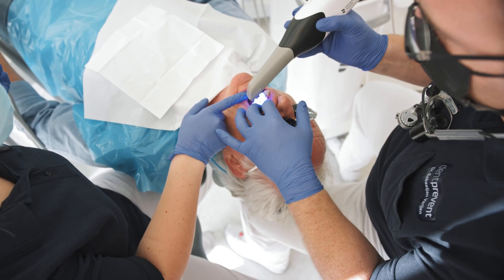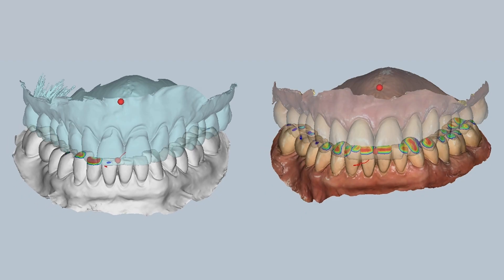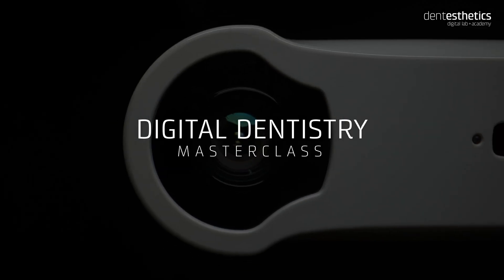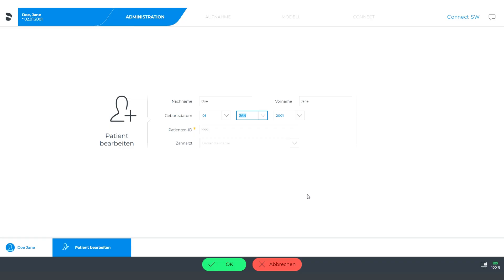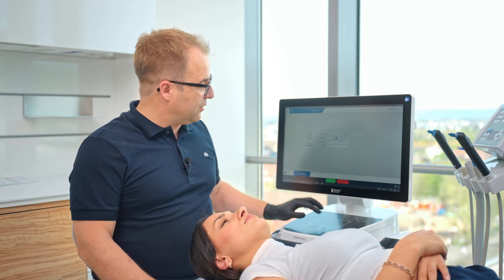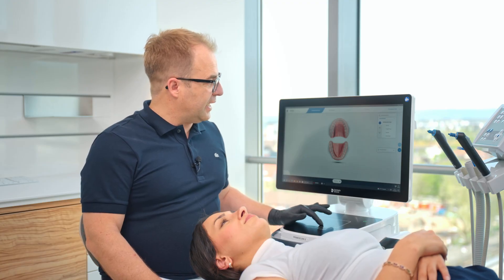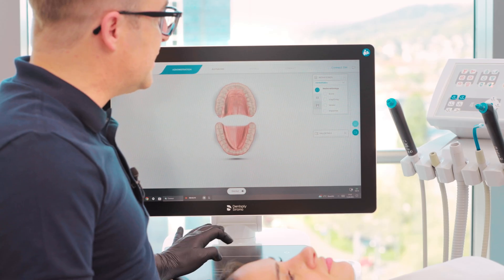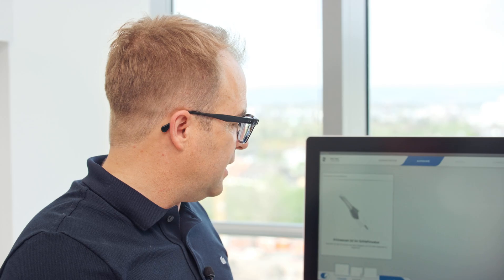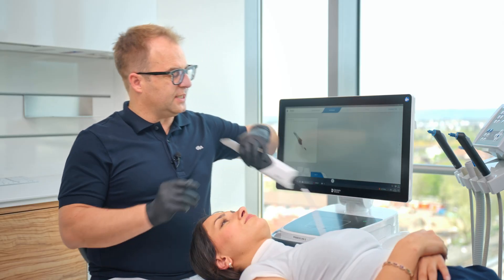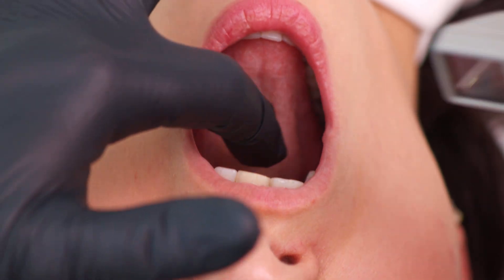Let me show you how it's done. Let's get started with the intraoral scan. We have here the patient's name, birth date, and patient ID — I can confirm that. Now we can choose what we're going to scan. This is going to be a full arch scan for a splint. Now we can start scanning the upper jaw, so I'll take my scanner and start on the palatal side.